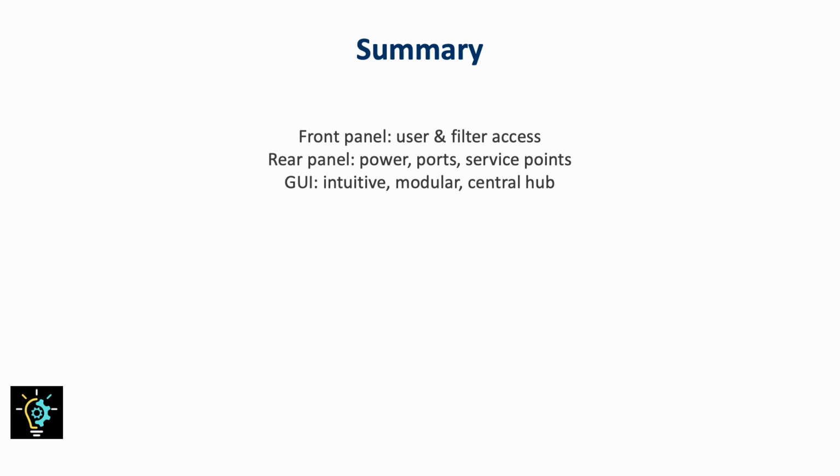By getting comfortable with each of these panels, you'll be better equipped to handle both daily operation and maintenance. Remember, ventilators aren't just machines, they're life support systems. Knowing how they're laid out and how to interact with them can make the difference between smooth operation and stressful downtime.